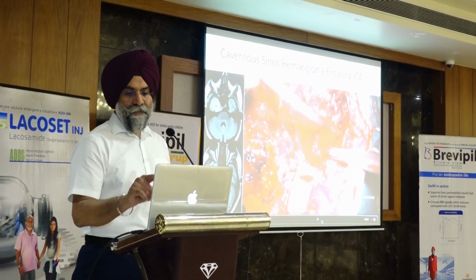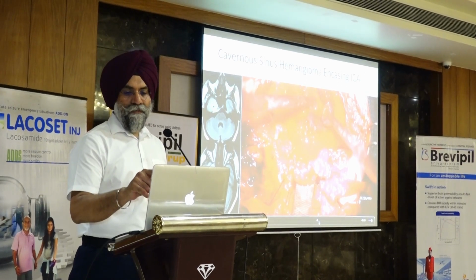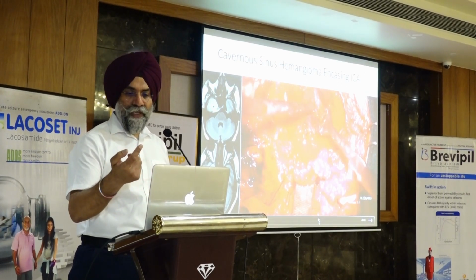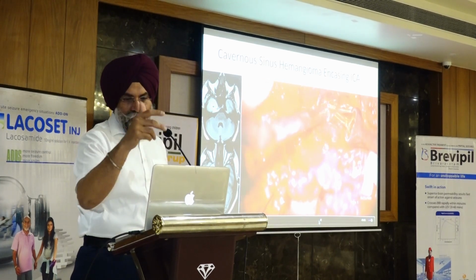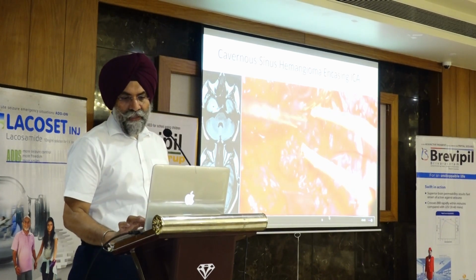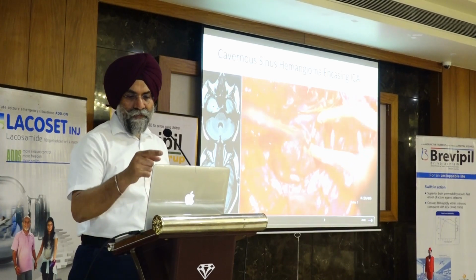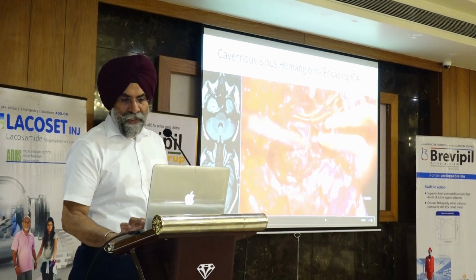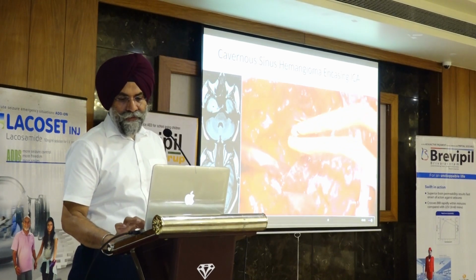So there was one branch, one of the meningeal branches, which actually got cut very close to the ICA, and I just applied the clip and continued that. So the ICA per se is not clipped, but you see a lot of branches coming out of the ICA here, which were individually caught and cut.